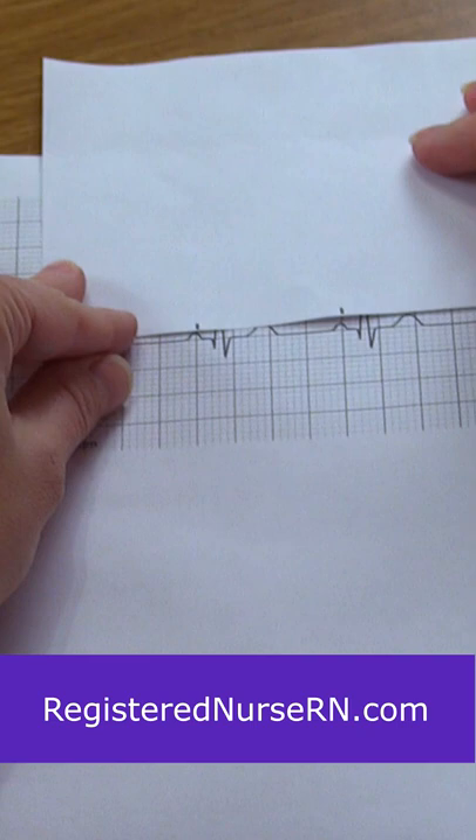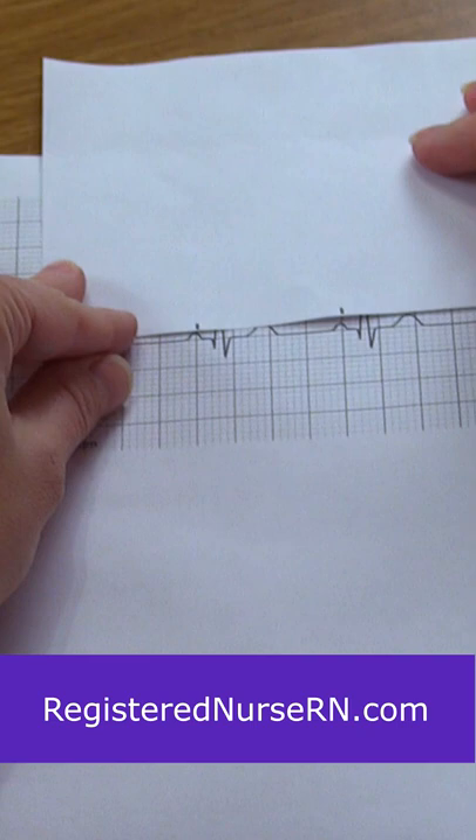Then you can do the same thing with the QRS complexes. Mark the R wave, mark the other R wave, and then just go straight down that strip making sure they're regular. Makes your job a little bit easier.